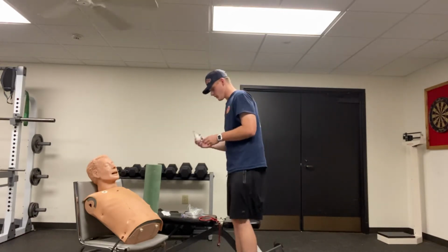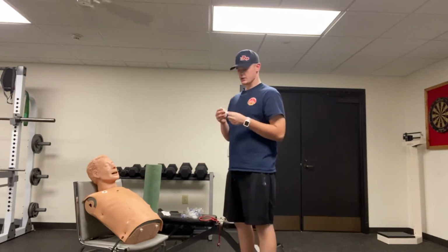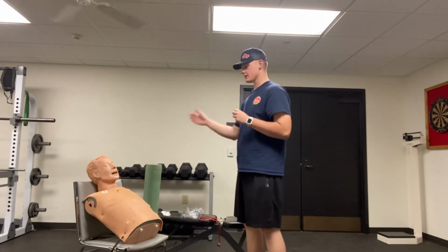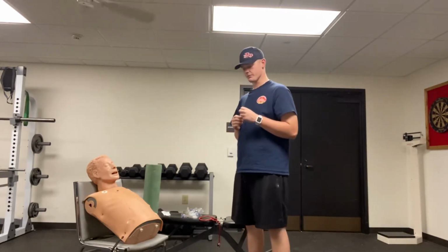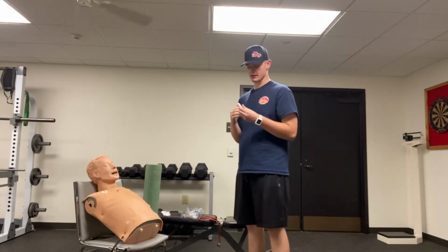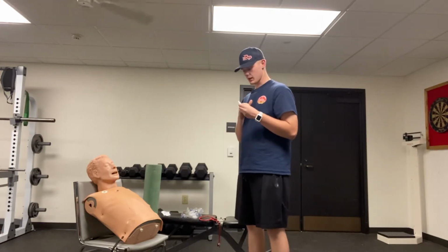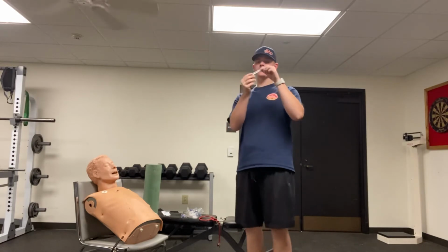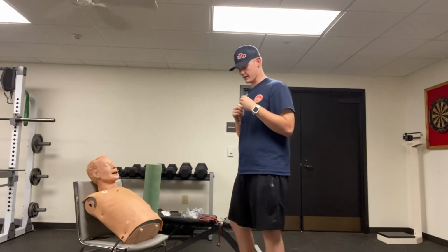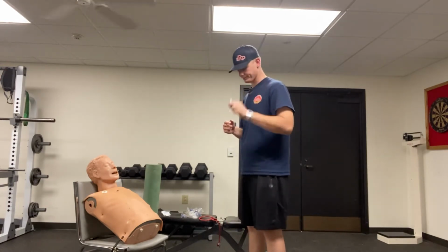So what I'm going to do is assess my medication, making sure that this is the right patient. This is the patient that I will be administering the medication to. The right medication, which is right here. In order to see that it is the right medication, I'm going to look at the date. I'm going to look for the clarity, making sure that I don't see any discoloration. And then I'm going to note the time of this administration of medication.